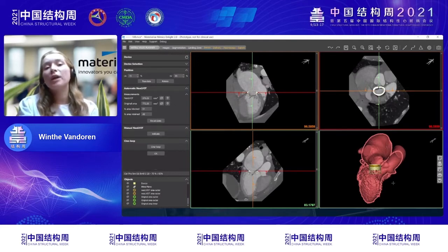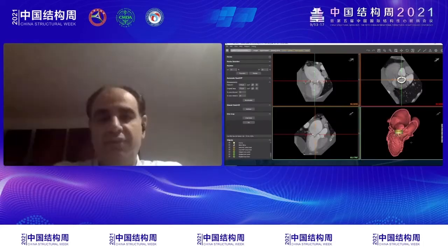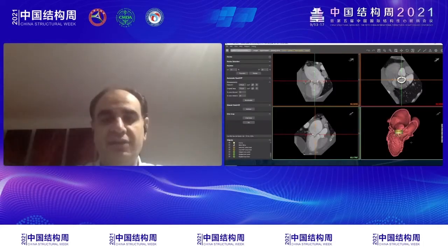Whereas when you do a manual measurement on CT scans, of course, you will never come as close to reality as you can with volume segmentation. Is that an answer to the question? Yeah, it's a perfect answer, actually. Thank you for your explanation.